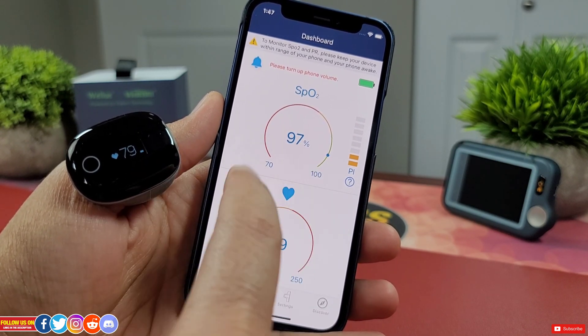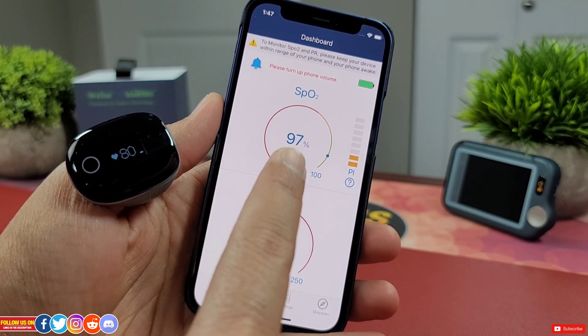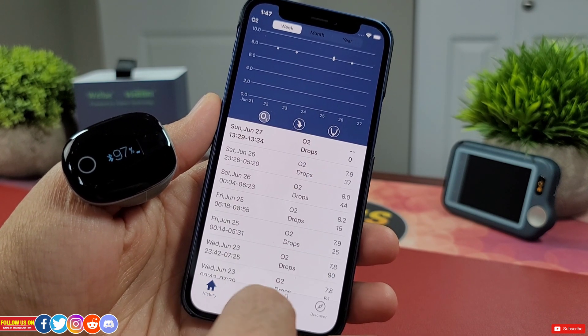Going back under Dashboard, it will show the real-time SpO2 and pulse rate data along with the battery level of the device. Under History you will find all your readings.